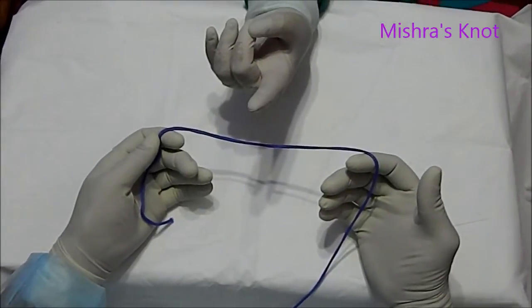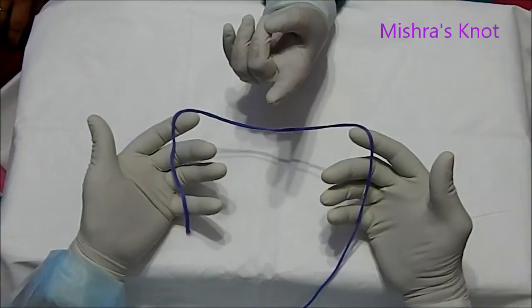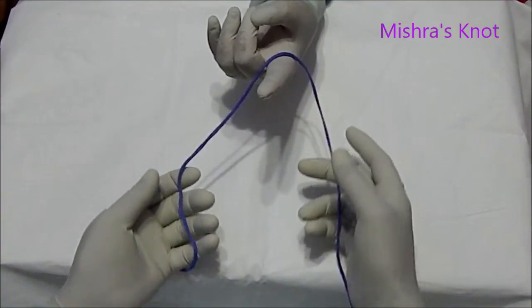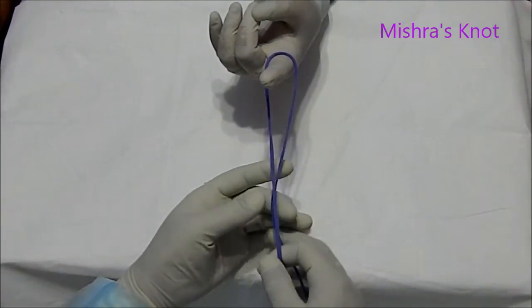Today I am going to demonstrate to you the Misra's Knot. This is the short limb, this is the long limb. You will ask one assistant for the finger. The shorter limb has to be crossed over the longer.